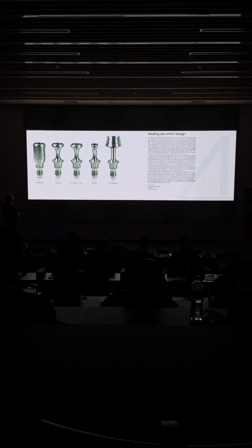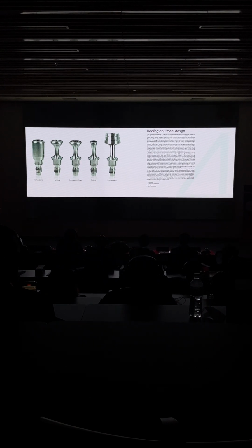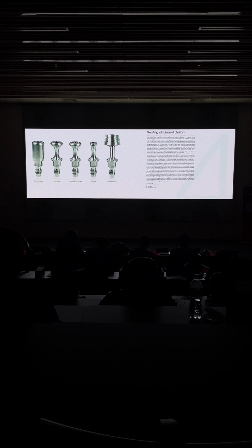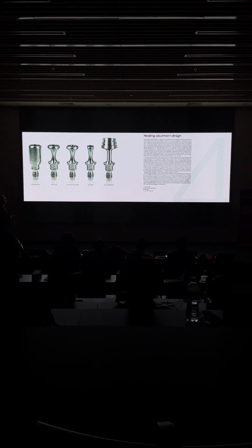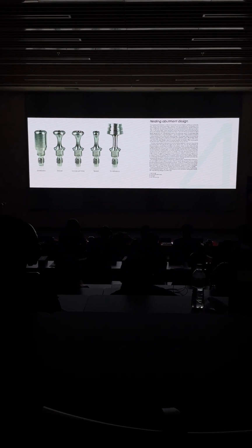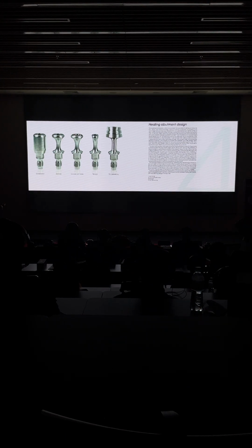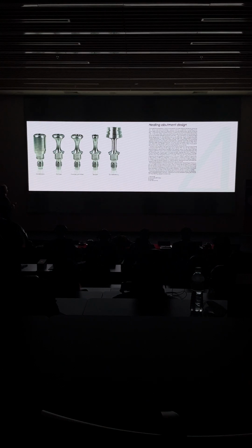We were not using straight conventional abutments because what we wanted was to improve the thickness of the soft tissue and really be able to create an abundance of soft tissue and be able in this way to hide better the connection with our implants.